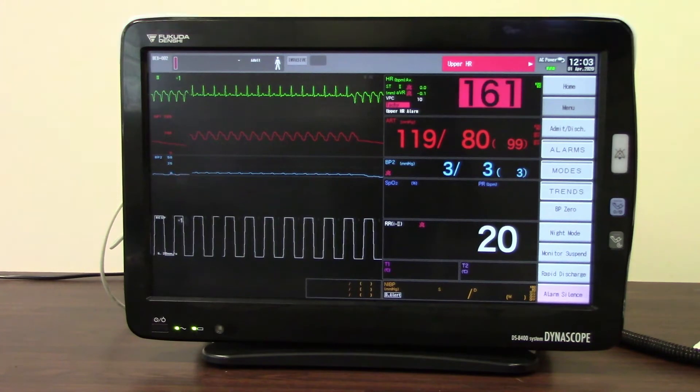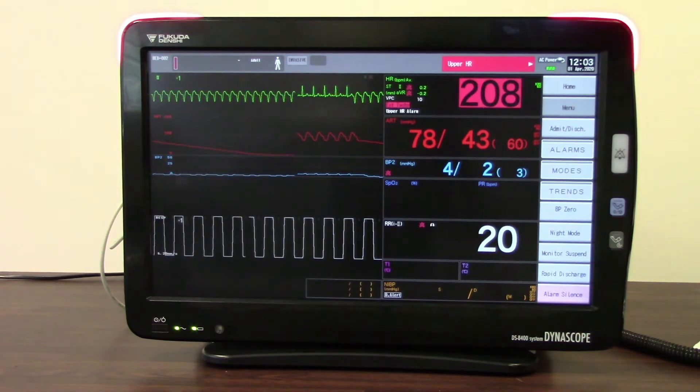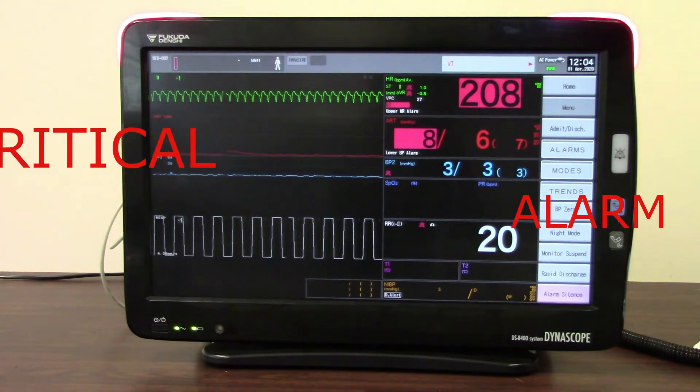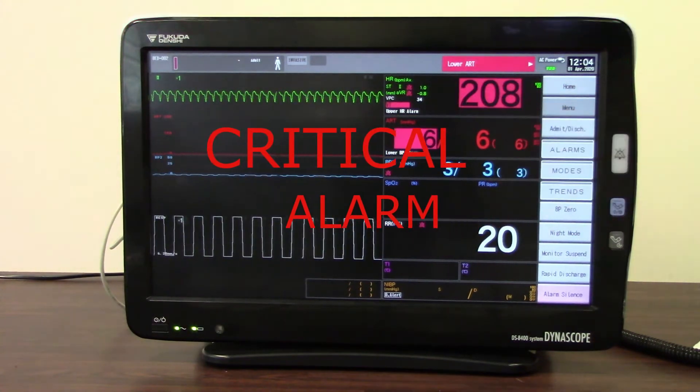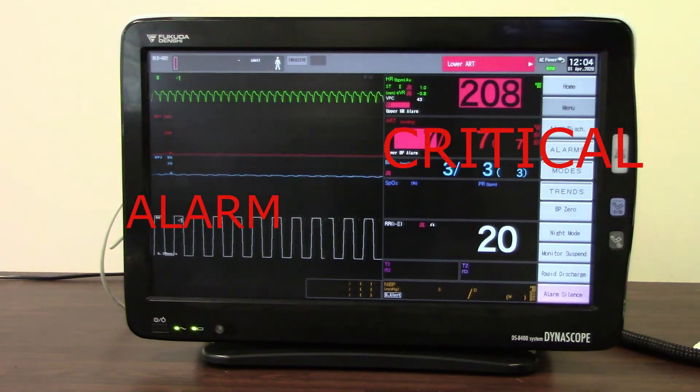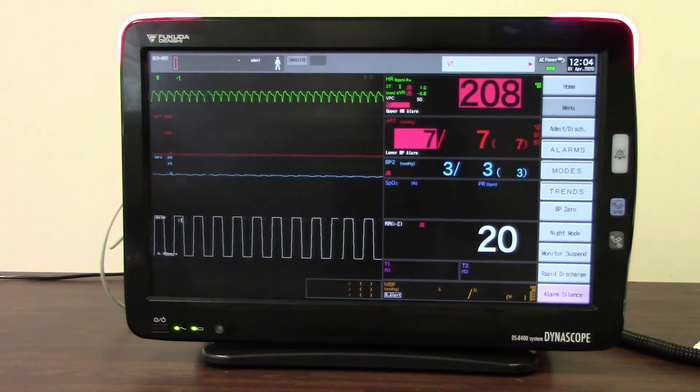Lastly we're going to listen to our critical sounding alarm. We can see here that we've got a VT on screen. Again the parameter is highlighted and you get an alarm message at the top of the screen.